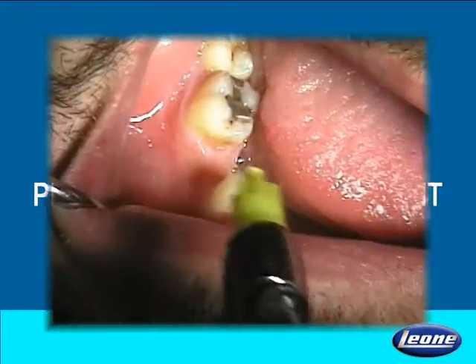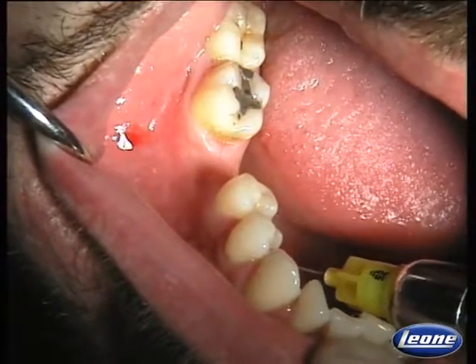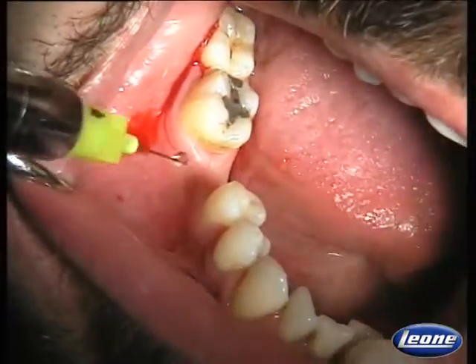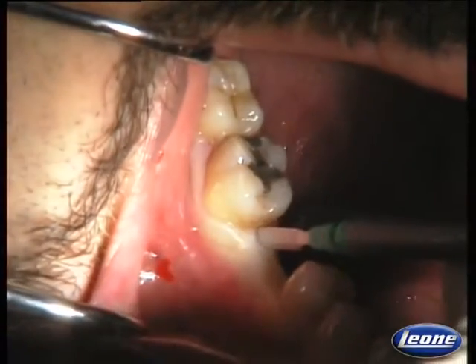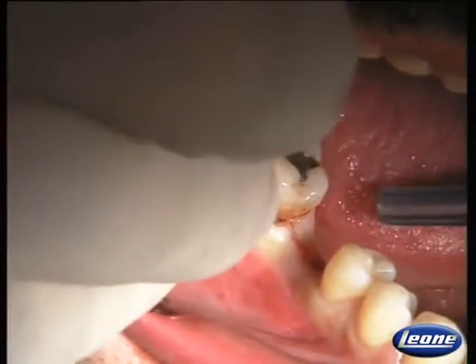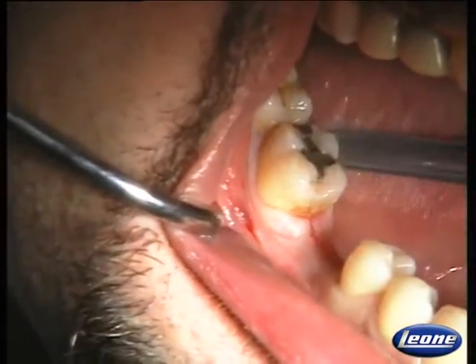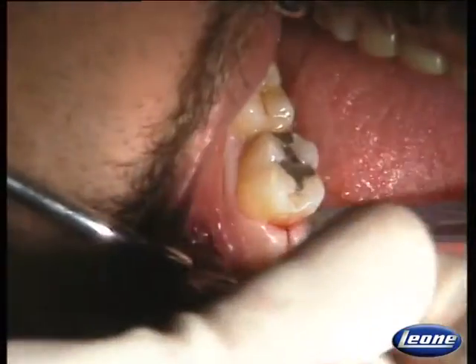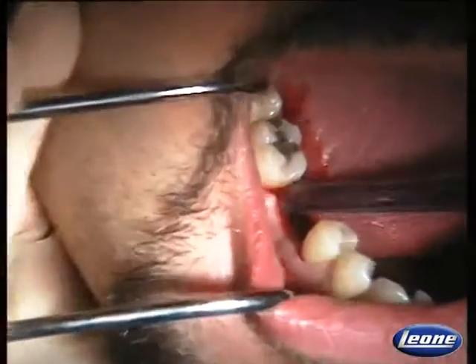We anesthetize the area with local anesthetic. The buccal side, slightly the lingual side, and the crest of the ridge. An incision is made in the middle of the attached gingiva, and buccally and lingually within the sulcus of the adjacent teeth. Then a full thickness flap is carefully raised to expose the area of interest.